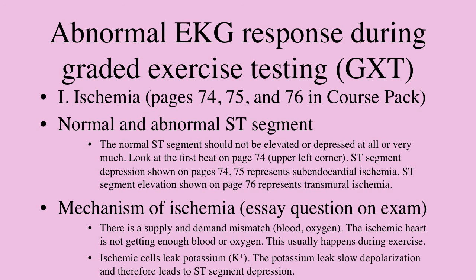And this is the common thing that you will see as a clinical exercise physiologist day in and day out, all the time. You might do 6 or 8 or 10 exercise tests on cardiac patients, and you might see this 3 or 4 times in a given day, this idea of ST segment depression representing subendocardial ischemia. A lot of these patients have symptoms of angina, and they end up going to the cath lab for a catheterization, and a lot of them end up having angioplasty or bypass surgery, and it's a very common, day in and day out scenario. So it's important, and we'll come back to measurement of the exact magnitude of the ST segment depression in a few minutes.